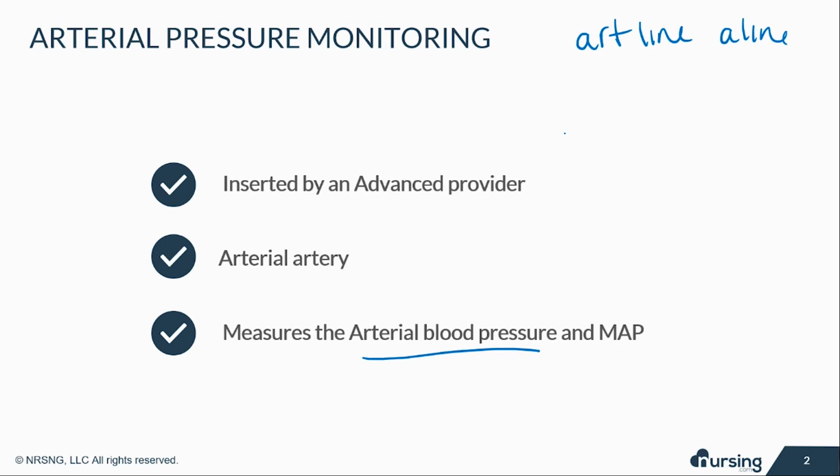It can also be used to draw blood gases or just typical labs that you need to send down. That way the patient doesn't get stuck. It is usually inserted by an advanced practice provider, usually a doctor or a nurse practitioner, CRNA, anesthesiologist. Typically, nurses are not able or allowed to insert art lines. Again, depending on facility, but for the most part.